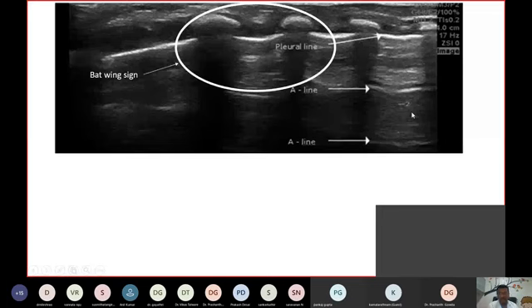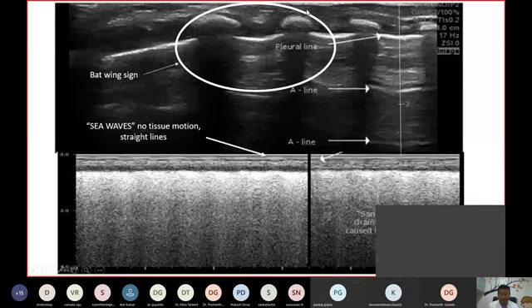What it means is the motionless upper part, which is formed by skin and soft tissues, the brightest structure pleura, and then motion of the lung is represented by a shore or grainy appearance, what we call sand on the beach.